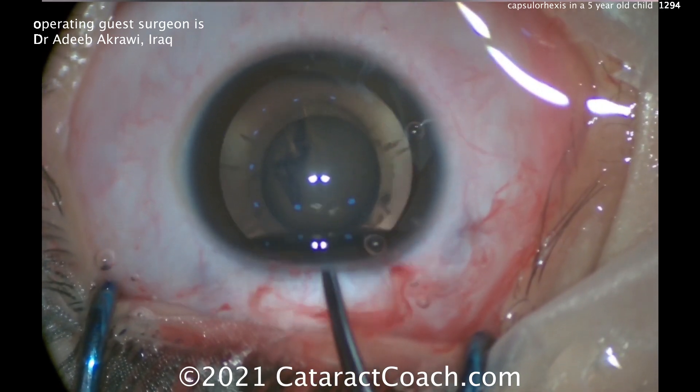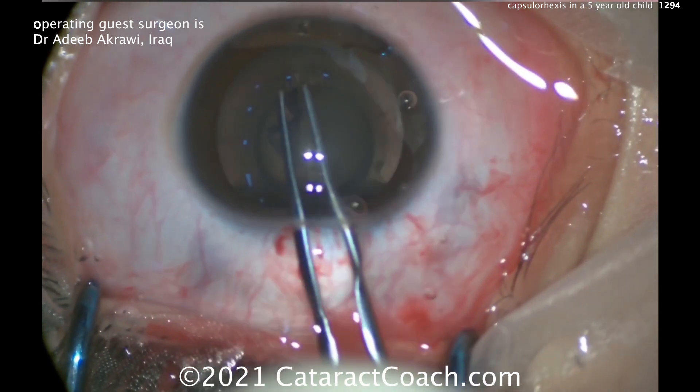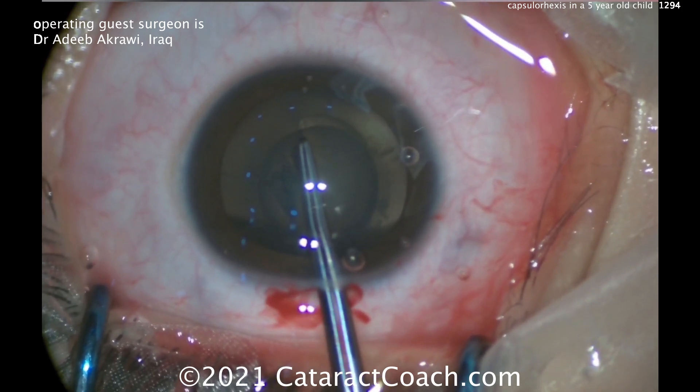Now the lens here of course is very soft, there's nothing to worry about. The lens is very soft, so at the very end just the forceps to grab the very last tip of it, just to finish that up — a little bit more control with the forceps.